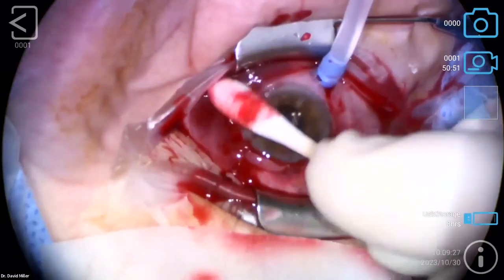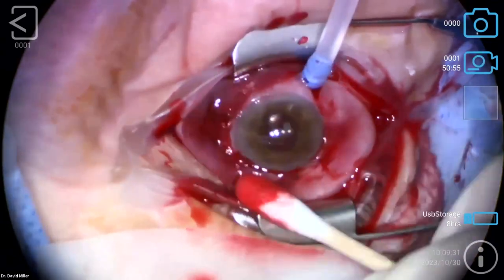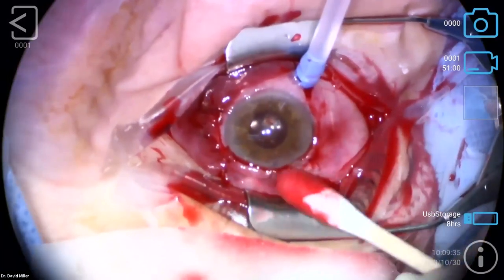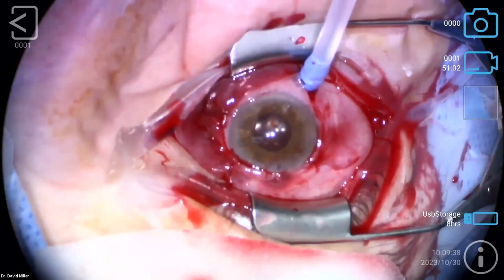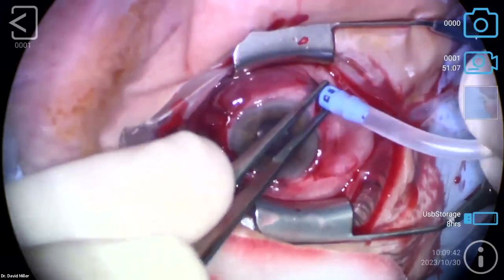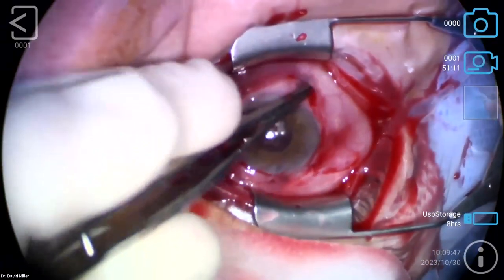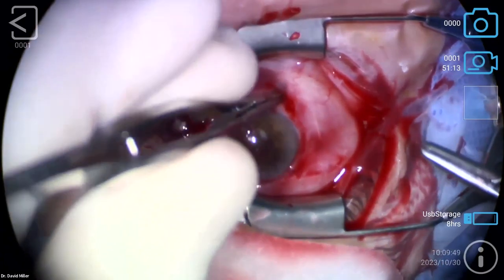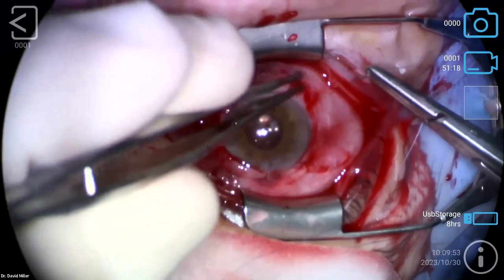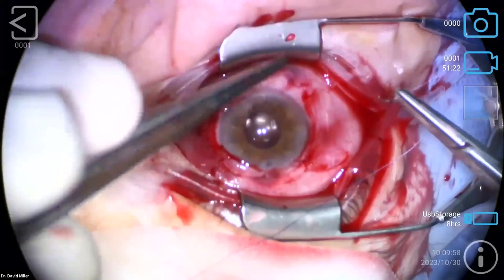And so we're just going to take a look over here real quick. See the conjunctiva is up to the limbus, a little subconjunctival blood, not a problem. Everything's watertight. And then we're going to pull out this one to place the last suture. Then this one, we can press on the wound right there again, on the top of the wound, to make sure that leak is closed. I'm not looking to close that up if I don't have to. Eye's well pressurized.